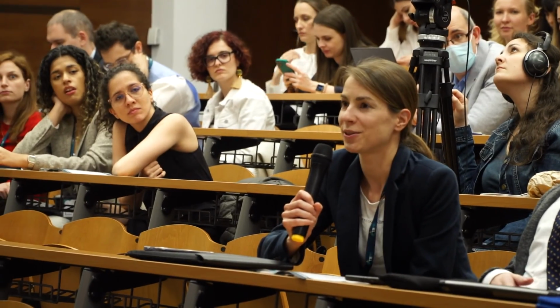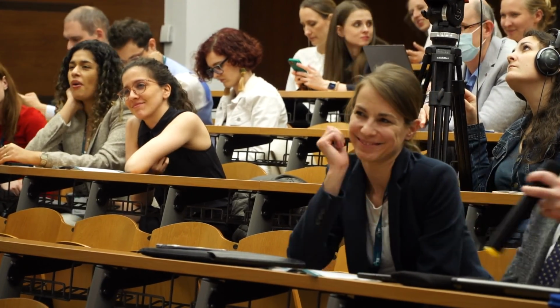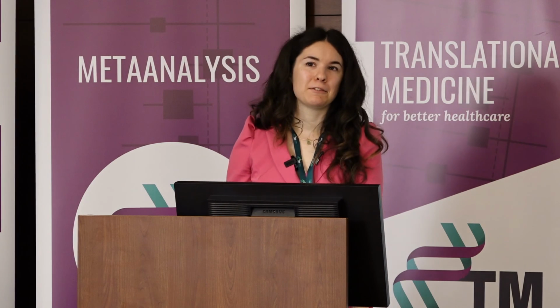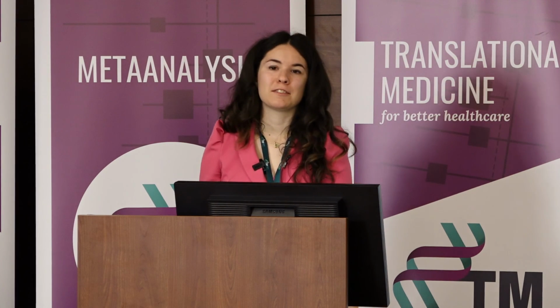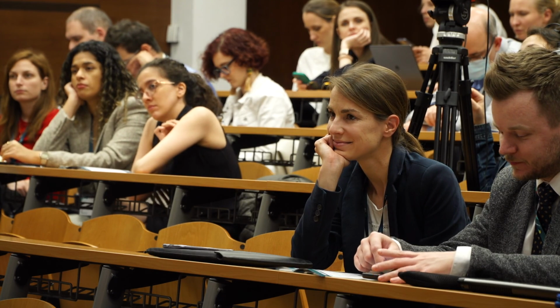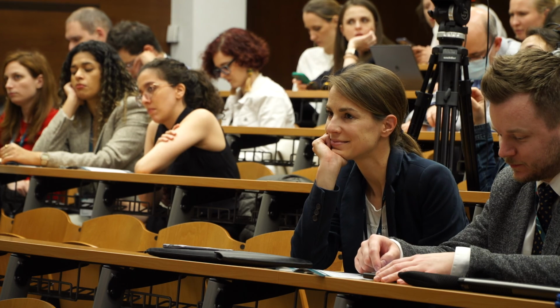Could you suggest a scanner for the conservative dentistry department? Mostly in conservative dentistry, they don't really use full arch restorations because mostly for the rehabilitation they use inlays, onlays, and crowns, for example, or veneers. So these are single restorations.